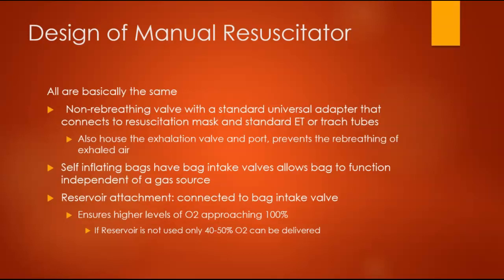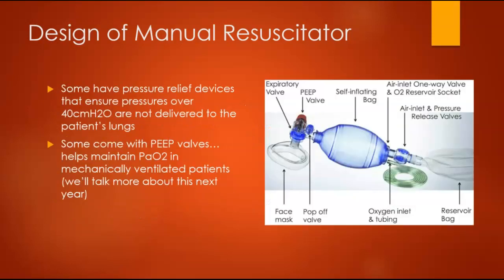That reservoir attachment should be on the back of the bag that connects the bag to an intake valve. This ensures high levels of oxygen being provided. So if you don't use a reservoir, your ability to get high concentrations of oxygen decreases significantly. And then there's some other things when we're talking about how to ensure the best oxygenation. A couple different things we'll cover with how we actually squeeze the bag that can help.